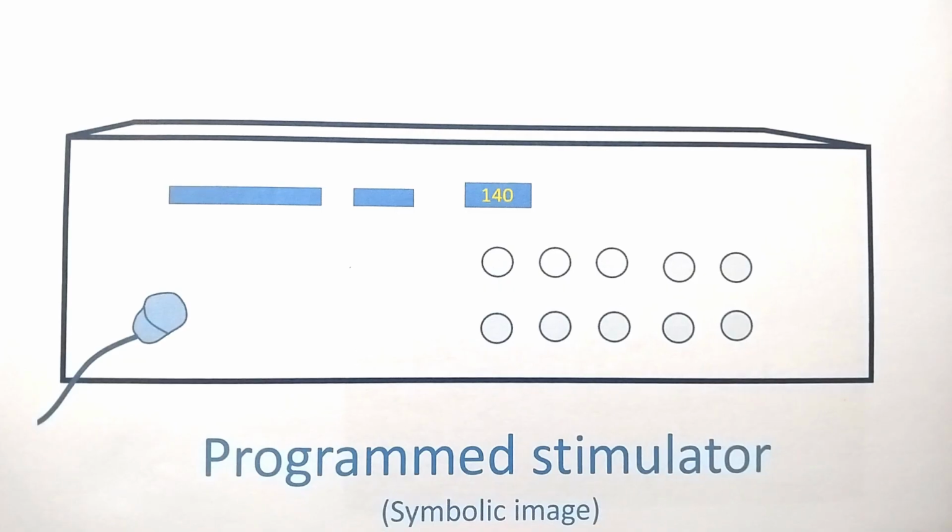Initially, the normal conduction sequence of the heart is assessed. After that, signals are given artificially from this programmed stimulator into various points of the heart, and the change in conduction sequence is assessed. It also tries to see whether the abnormal rhythm which occurs spontaneously can be reproduced exactly in the electrophysiology lab, because when the test is being done, abnormal rhythm may not be there.